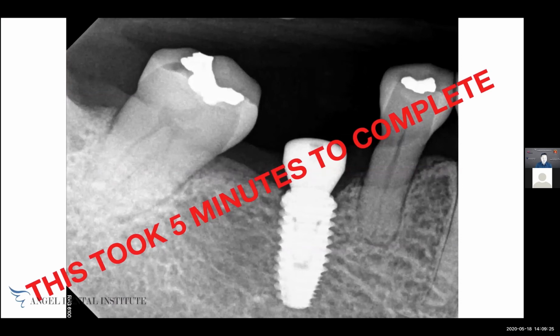I'm not saying that it'll take you 5 minutes initially if you've never done an implant before, but after a couple of experiences, something like this really should not take more than half an hour. I think it's going to get to a point where it's going to take about 10 to 20 minutes at the most. And when you do a procedure like this with the tissue punch so fast, there's less trauma to the patient. The patient really doesn't have any pain, and you're going to get a lot of referrals.